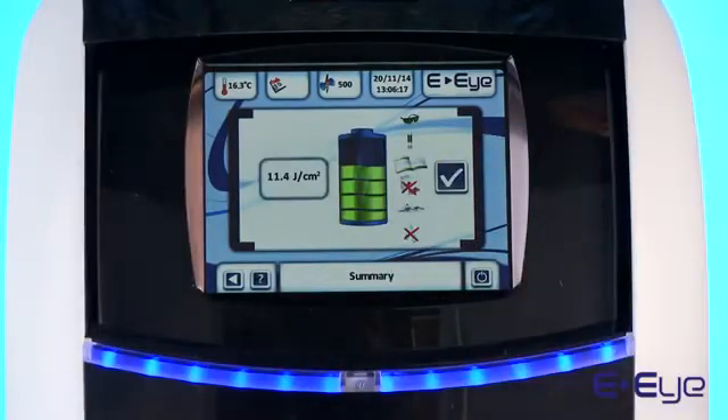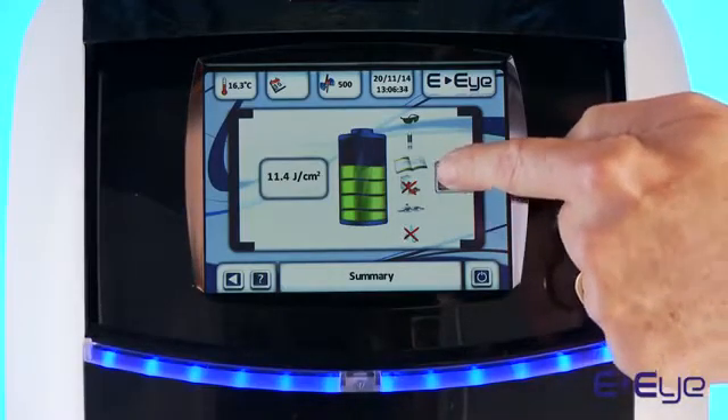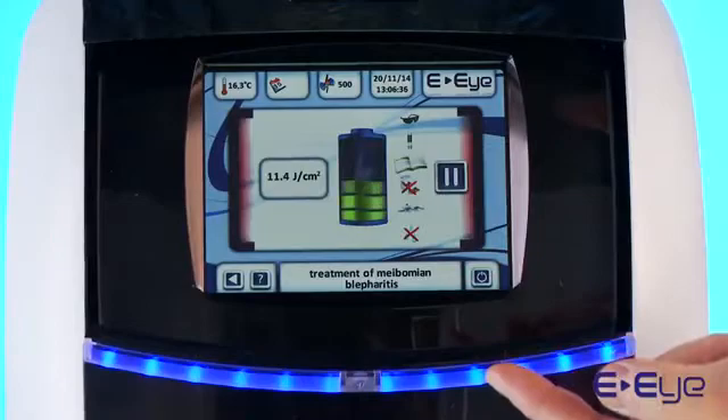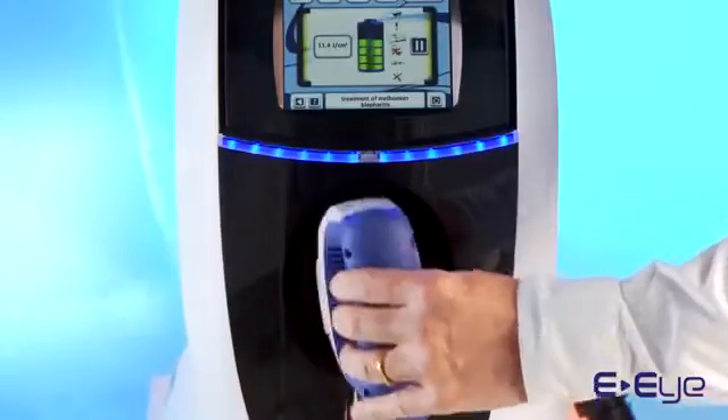A summary of your selection will now be displayed on screen. Simply confirm your selection and wait until your device is fully loaded. Your device is now ready for use.